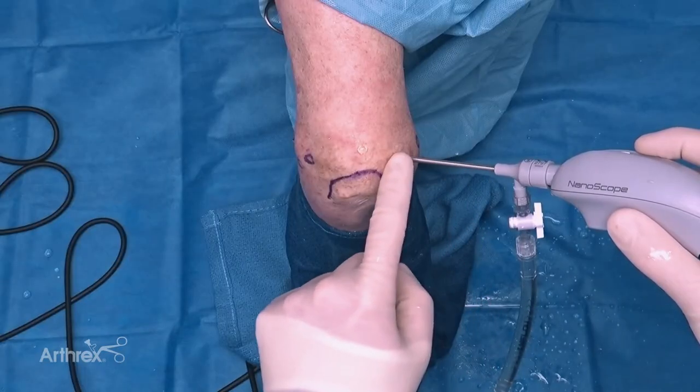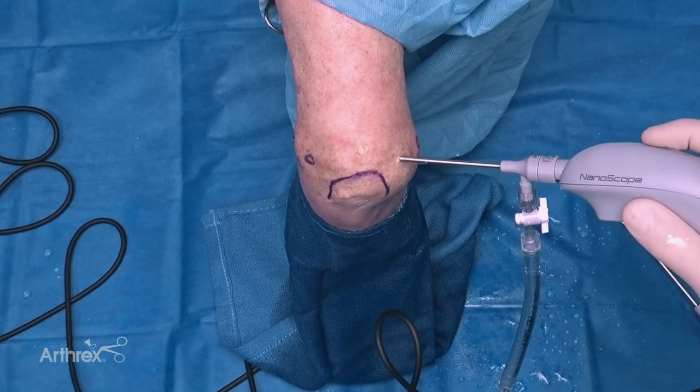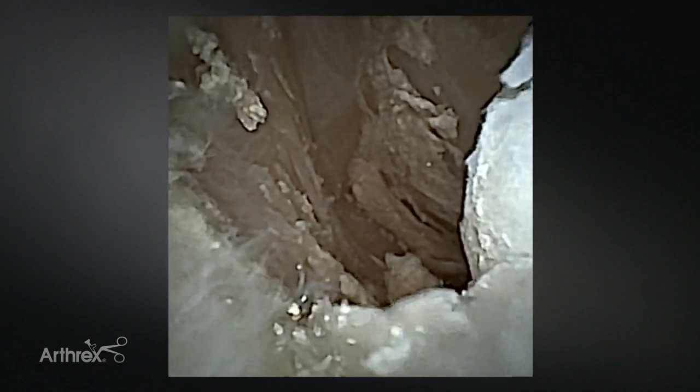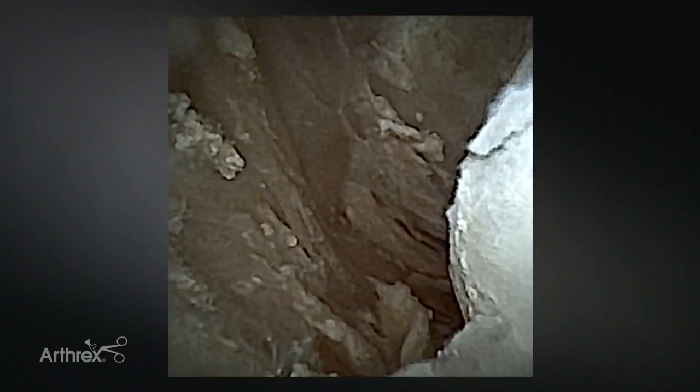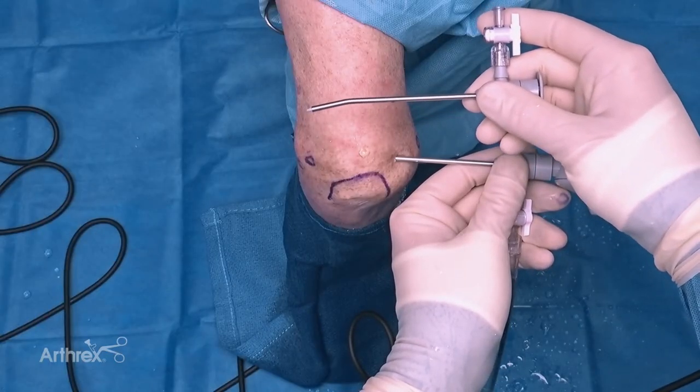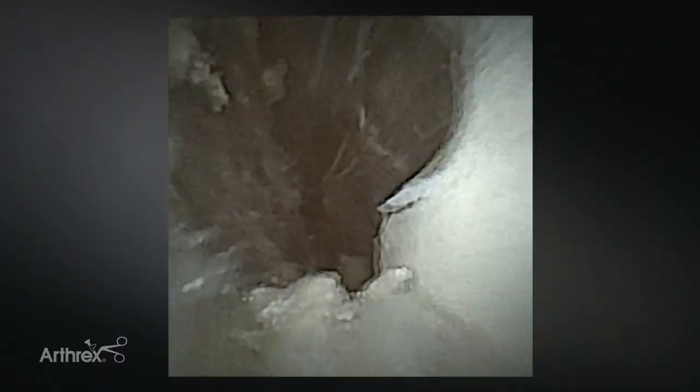I'm going to take you through a quick diagnostic arthroscopy. I'd like to point out the fact that I currently have the straight cannula on. Here's the tip of the olecranon, the olecranon fossa - we'll travel medially, here's the medial gutter. I'm currently viewing the medial gutter from across the elbow, from a lateral portal using a straight cannula. You can see it's a relatively wide view, and I'm coming all the way across. If I wanted a better view I could obviously use the curved cannula, or come in from my trans tricep portal and bring that around to view the medial gutter.